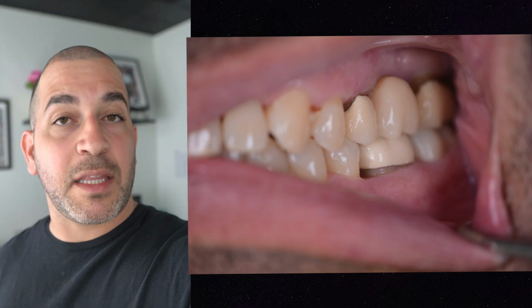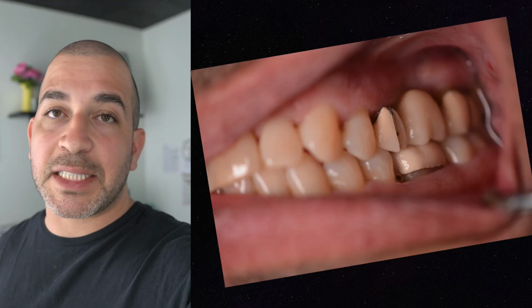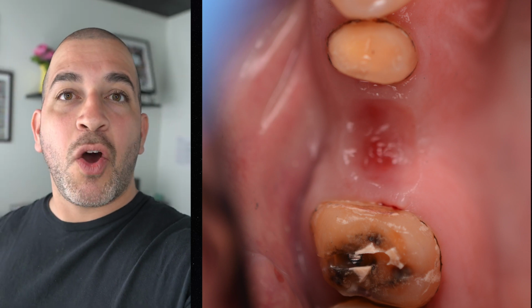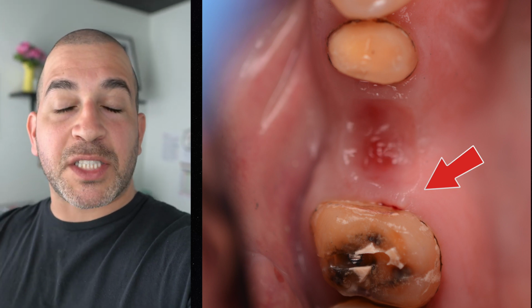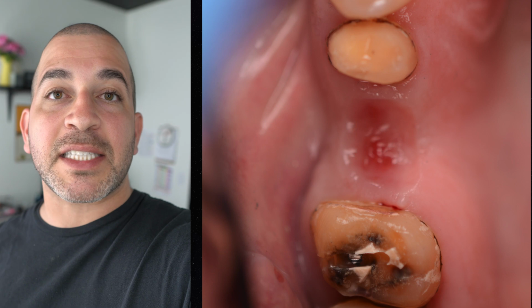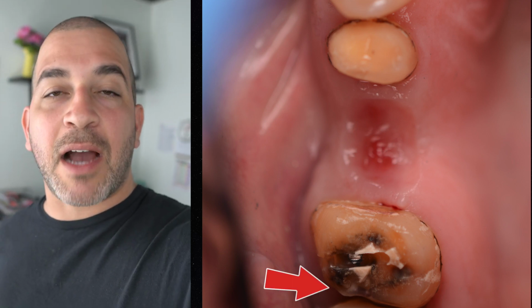So after getting the patient numbed up, we removed the bridge, we sectioned it into pieces and took the bridge off of the tooth, and this is what we were left with. As you can see, it doesn't look too bad. One of the abutments for the bridge is looking relatively healthy, and the other abutment, the one that we saw in the x-ray that had the deep cavity, we can't really see how deep that cavity is until we remove some of that outer tooth structure in order to really see how deep it is.